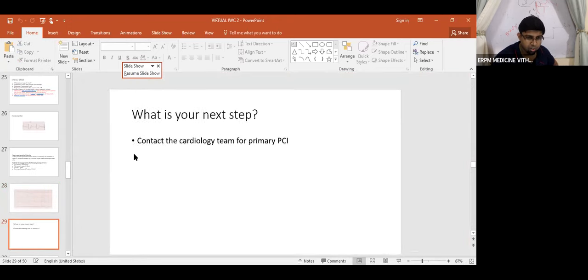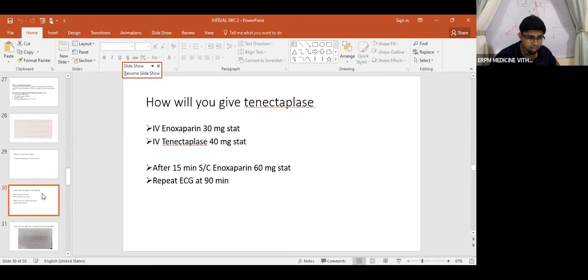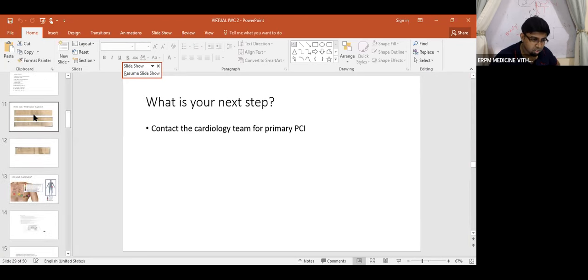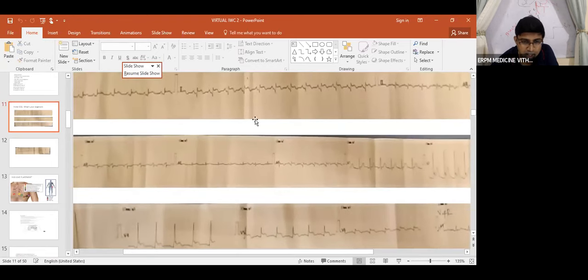Now coming to our patient. The background is clear now. What is the finding here? I told you all these things to interpret this ECG. You can use the axis deviation also. What is it? What is the finding here?